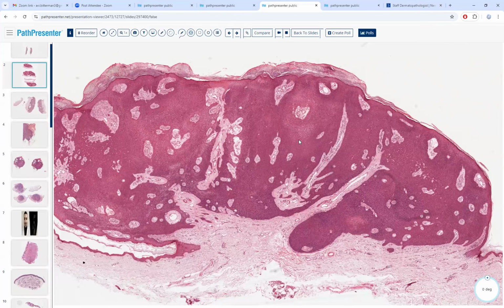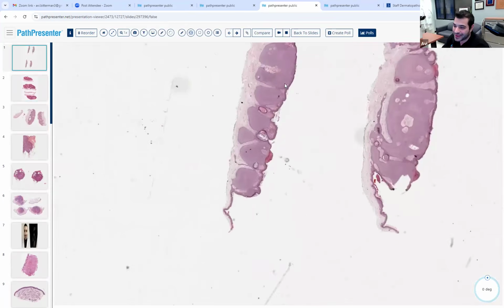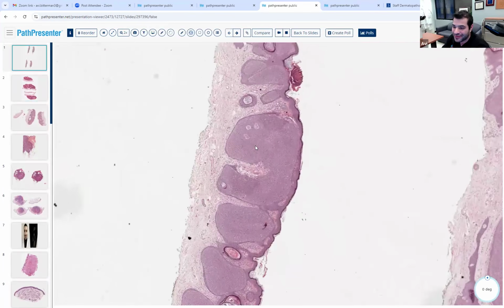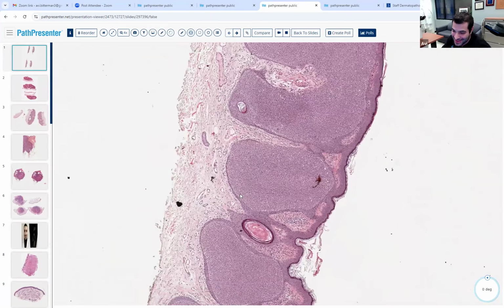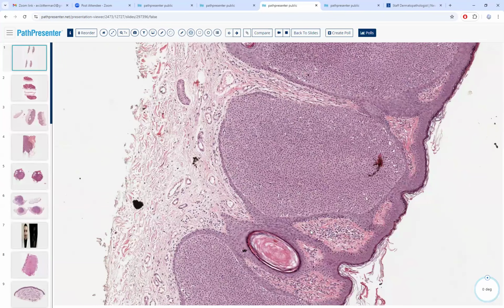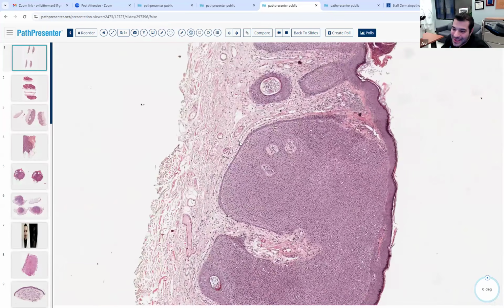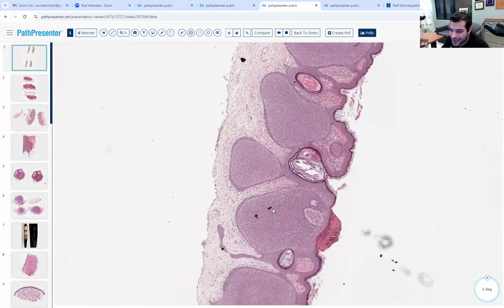I don't fully understand the classification, but this would be like a poroma. Yes, it would be a poroma. So this is a hydroacanthoma simplex. See how it's just epidermal? In fact, you can even see a lining over it. It almost looks like it's encapsulated in the epidermis. See how there's this lining of normal epi that seems like a pseudocapsule? It's not a real capsule. And you don't always see it like this, but this is wholly epidermal.